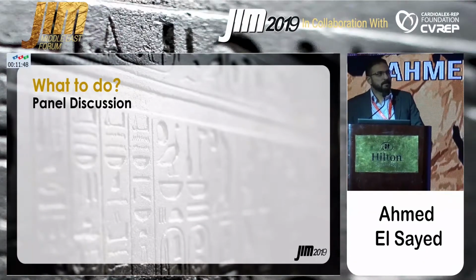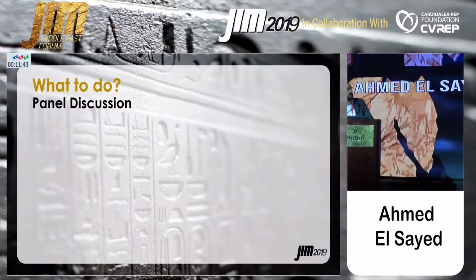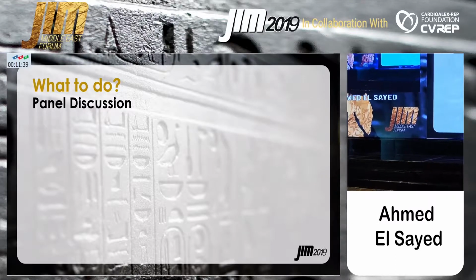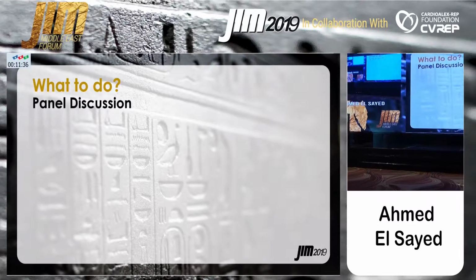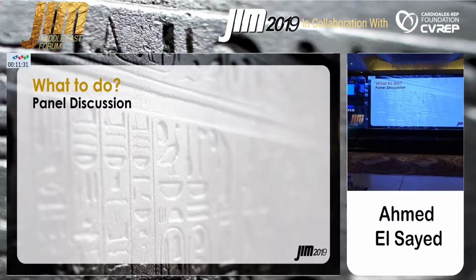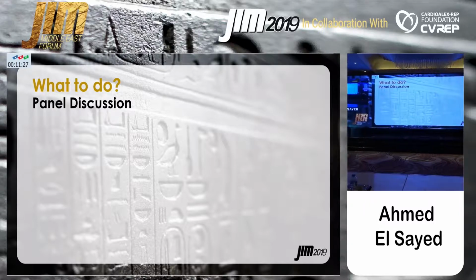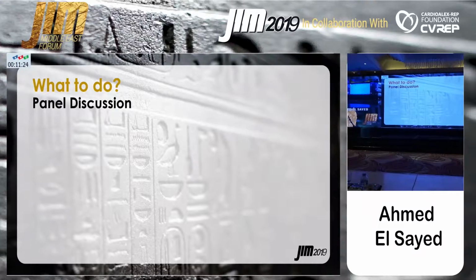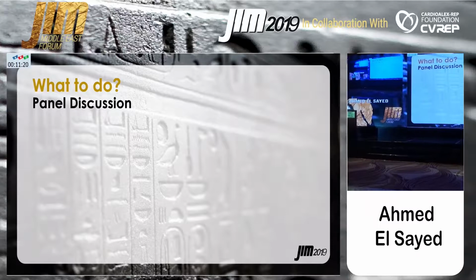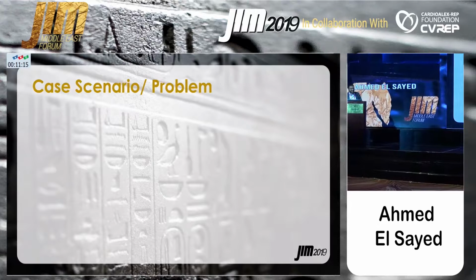Is anyone having any concern before proceeding to the TAVR procedure? My question is, who would do a routine balloon aortic valvuloplasty for this case with a low-seated right coronary artery? Nobody would do it. Okay.